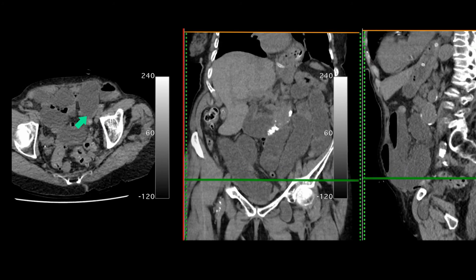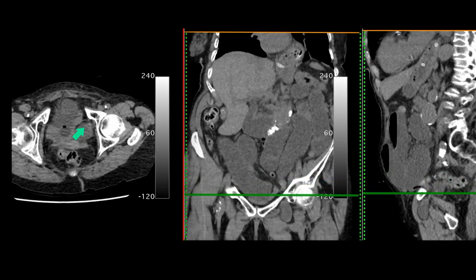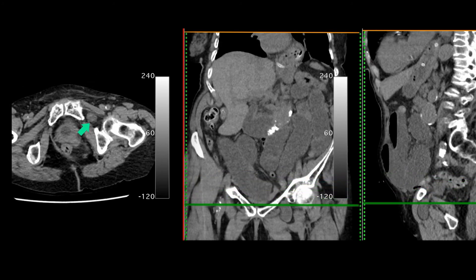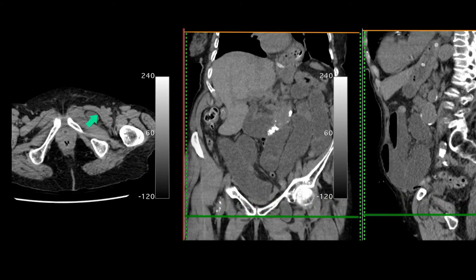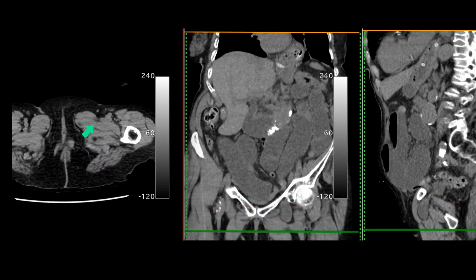In this particular case it is caused by an obturator hernia where the small bowel is trapped between the pectineus muscle and the obturator externus. This is at risk of strangulation. Here's the coronal reconstruction and the sagittal reconstruction showing quite a tight narrowing through which the small bowel has traversed.